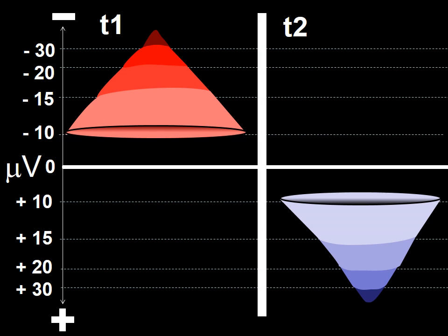In this frame, I have represented the two fields. They are both independent at a time because we have assumed that a single radial dipole generator is the source of all the potentials being recorded at one point by the EEG.